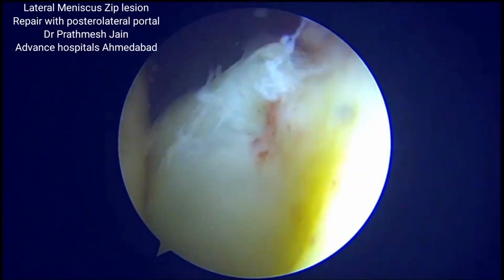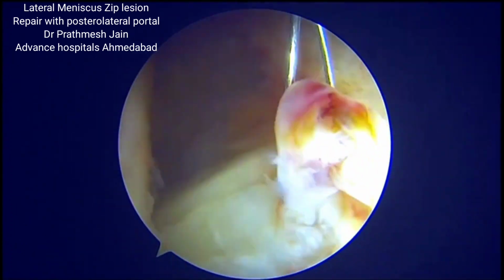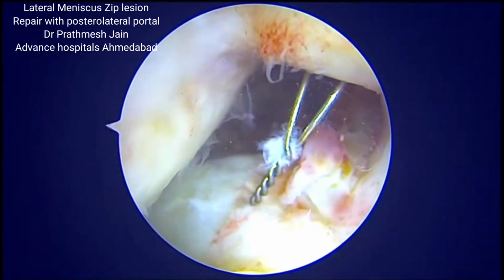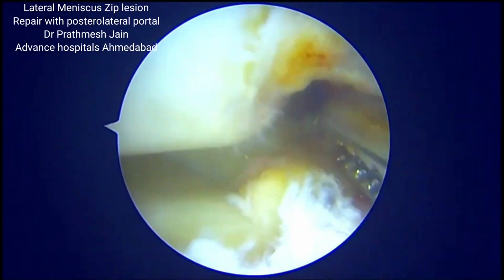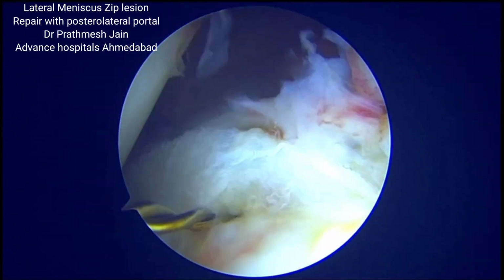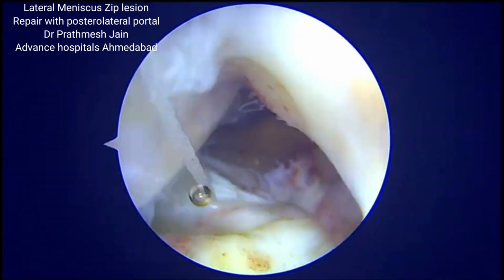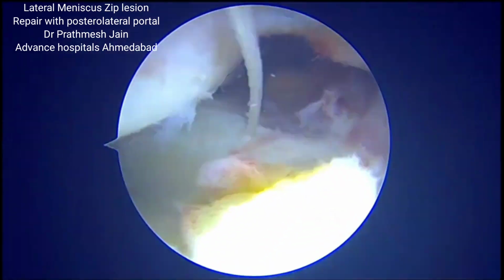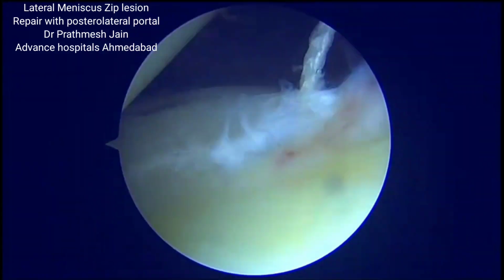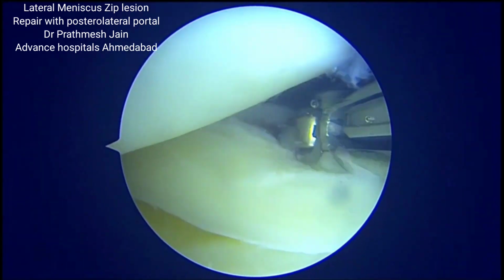portal. Here an ideal suture shuttle is passed from the posterolateral portal and a Chia suture passer is passed from posterior to anterior, and this Chia suture passer is railroaded with a small wire which is then tied and thereby reducing the zip lesion into its position.